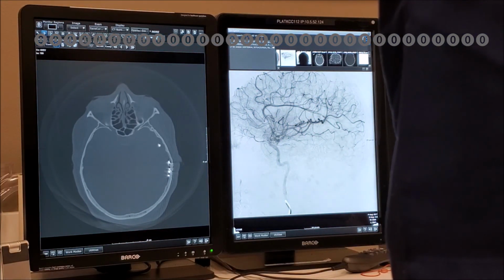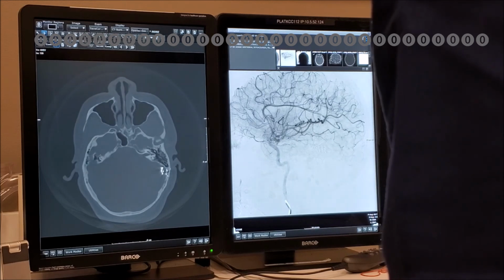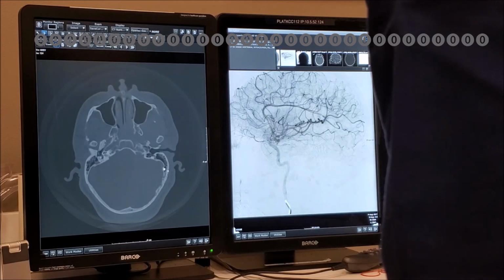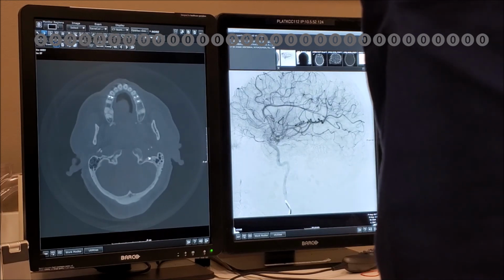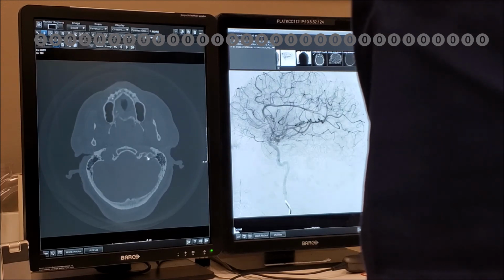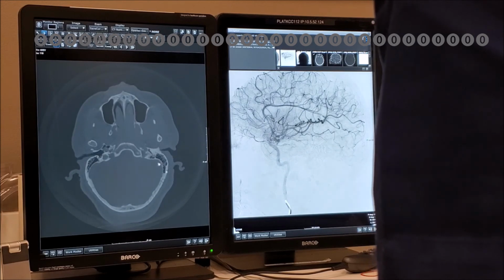Okay. So that's the Onyx cast. Coming north to south, that's the MMA as expected coming down to the transverse sinus, and that's going around the transverse sinus nicely. What I didn't really appreciate at the time is you can see this coming to here, then there's that. So I don't know if that's gone through the hypoglossal canal, crept down and gone. That's hard to know. See that?